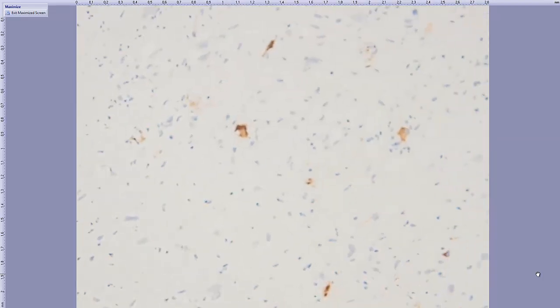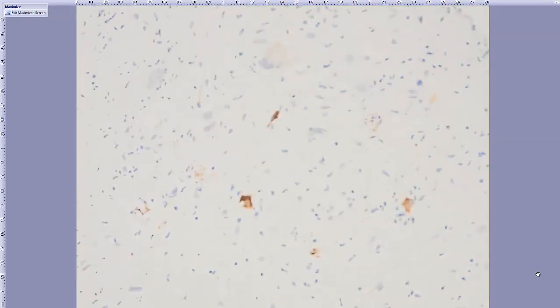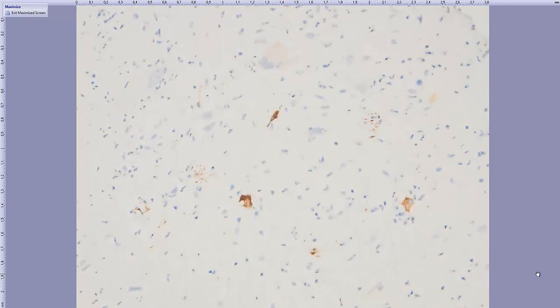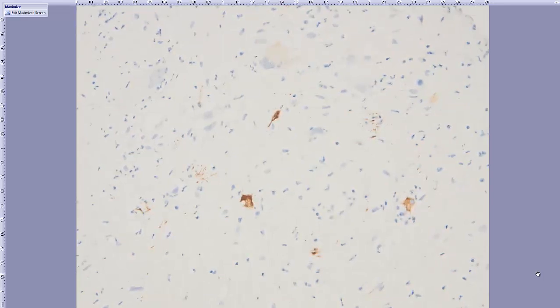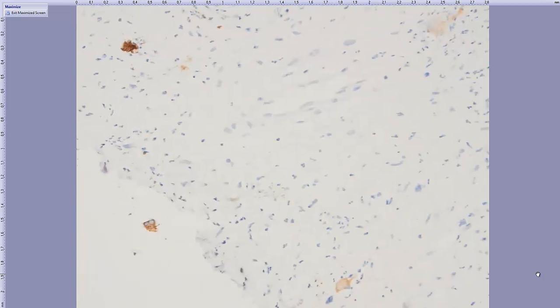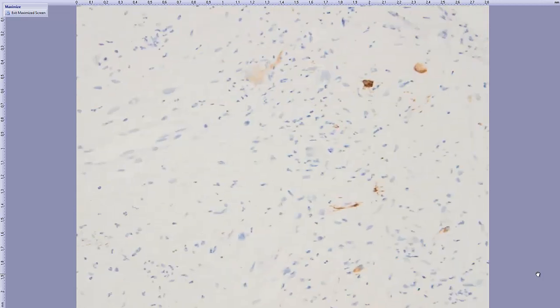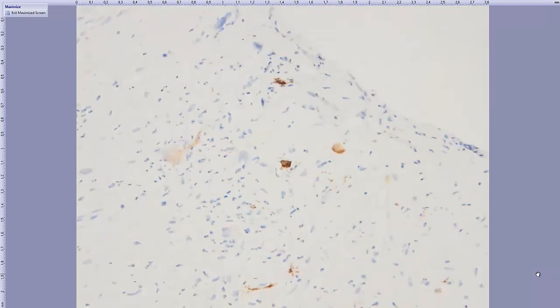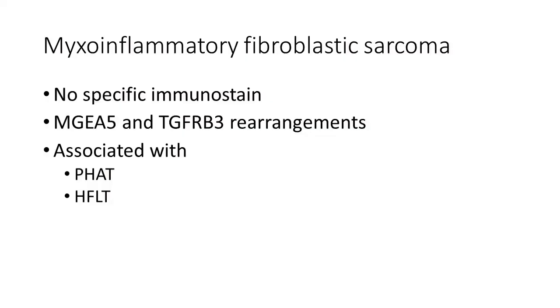Interestingly, some of the cases stain with desmin. In this particular case, the cells were also positive for desmin. Not every cell, but scattered cells showed desmin positivity, as you see here.